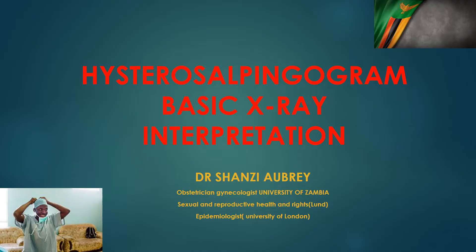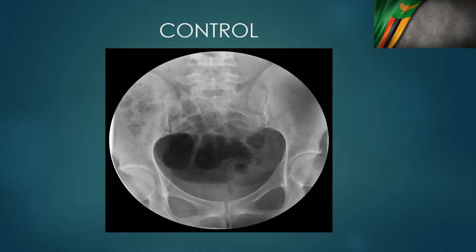Let's look at the images and have a basic understanding of them. As we already discussed in the other video, we normally take about four x-rays. One is a control, one is to look at the endometrial cavity, another is to look at the tubal lining and whether there is any blockage. We look at the tubes in the second x-ray, and in the third one we want to see the spill. We start with the control because we must compare the contrast images with the non-contrast images to make correct interpretations — otherwise we might call something a spill which was already there before contrast.